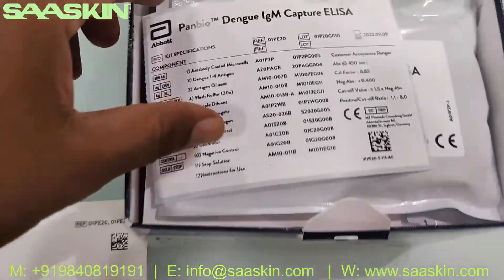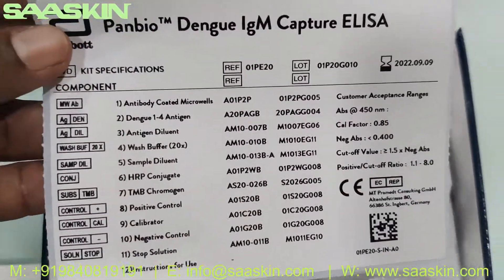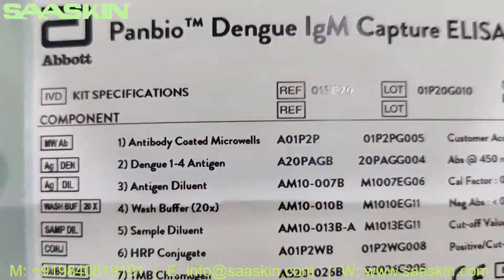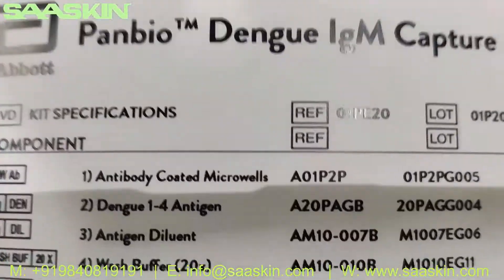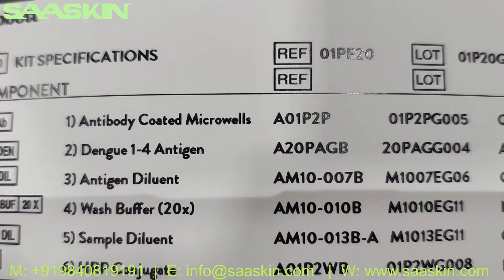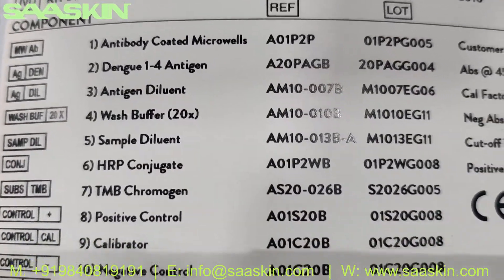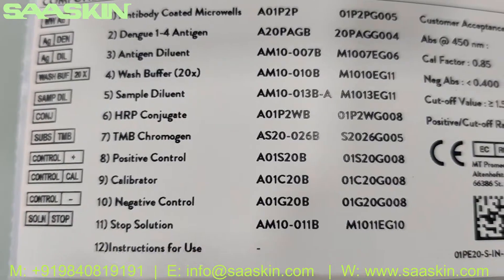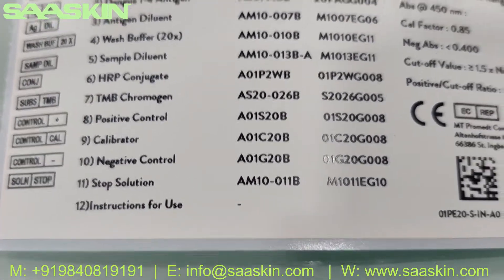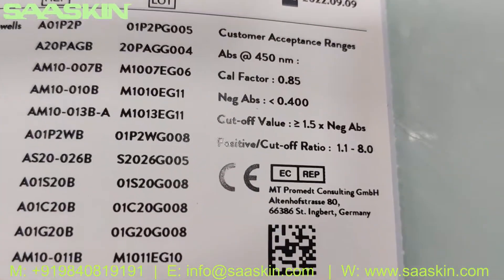You also have a content sheet which talks about the contents inside this kit. It says you have antibody coated microwells, Dengue 1-4 antigen, antigen diluent, wash buffer, sample diluent, HRP conjugate, TMB chromogen, positive control, calibrator, negative control, stop solution, and instructions for use.